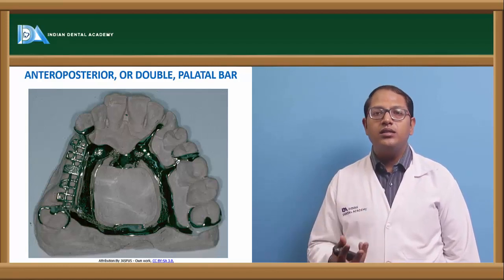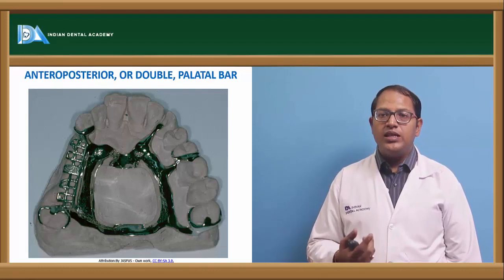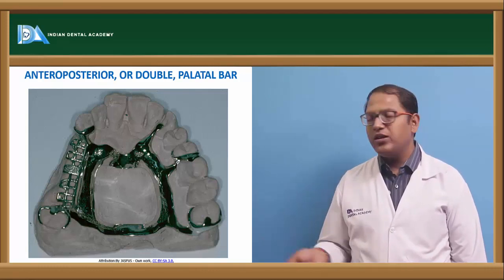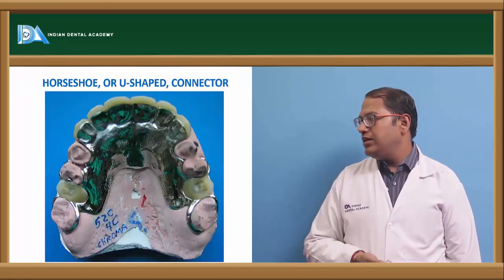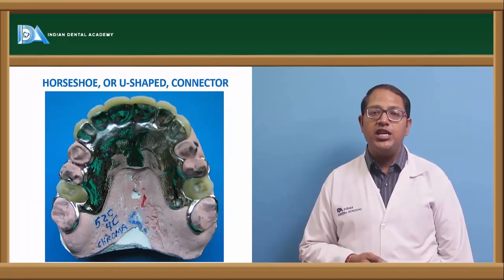So it is also a little uncomfortable to the patient in the long run. That can be a little disadvantage with it, but this is one of the best major connectors that we can give to any patient. Coming to the next one, a horseshoe shaped or U-shaped connector.